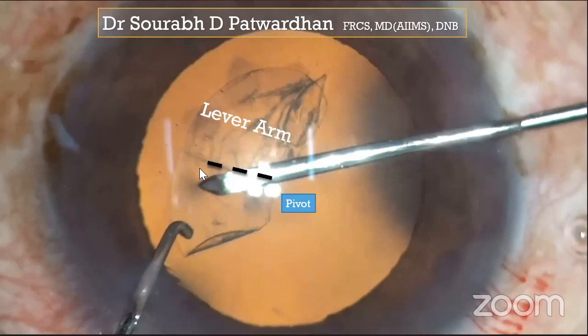Now I give a rule of center of triangle. What is this center of triangle? If you consider this imaginary triangle, which starts near the pivot until the capsulorhexis edge, it's an isosceles triangle. So it's a symmetrical triangle, and you have to hold the capsulorhexis flap at the center of it. When you hold it here, you will realize that you have much better control over the progress of this capsulorhexis than if you hold it far away or far closer to the edge.